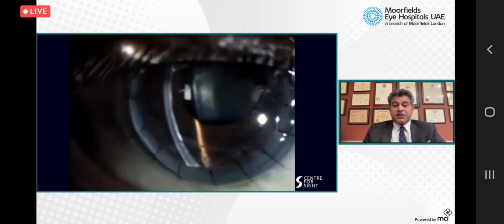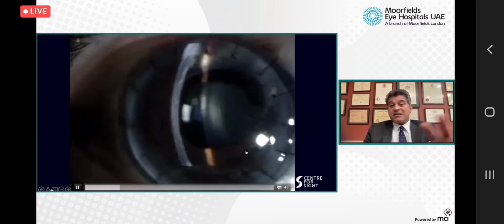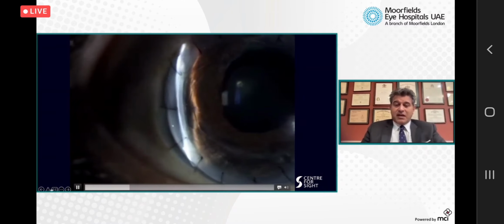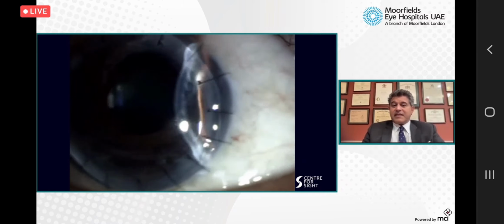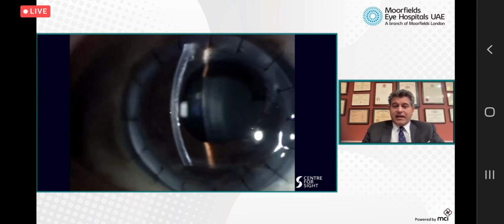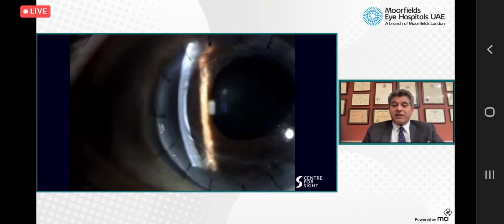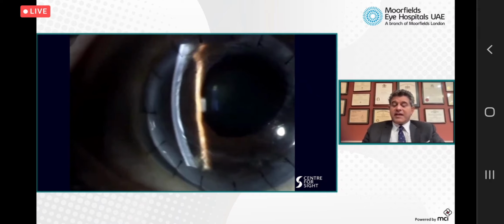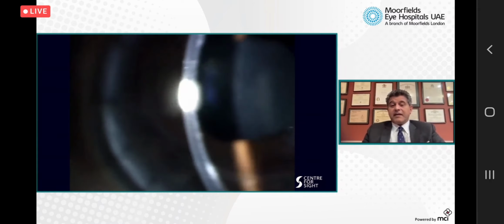This is one of my first patients that I did. You can see the old graft that's quite small, a 7mm graft that was superiorly displaced and had terrible peripheral thinning. He's now almost 20 years out, and I see him every couple of years, and he continues to do very, very well. So that's a deep anterior lamellar keratoplasty on an old PK.